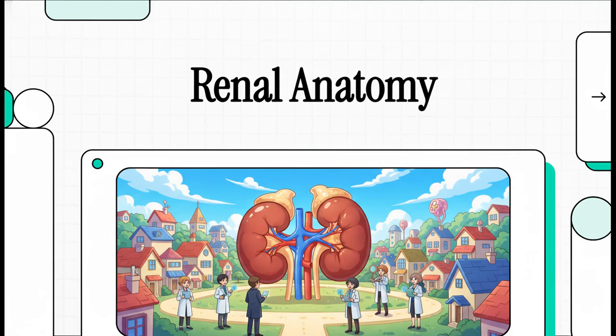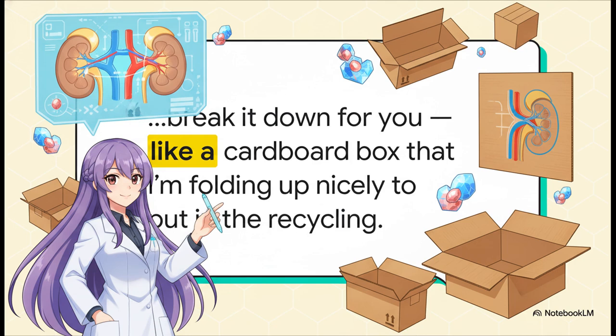All right, let's talk about renal anatomy. I know it can feel incredibly dense, super complicated, but the goal today is really simple. We're going to make this entire neighborhood around the kidney feel way more familiar and honestly, a lot less intimidating. And that's exactly what we're going to do.